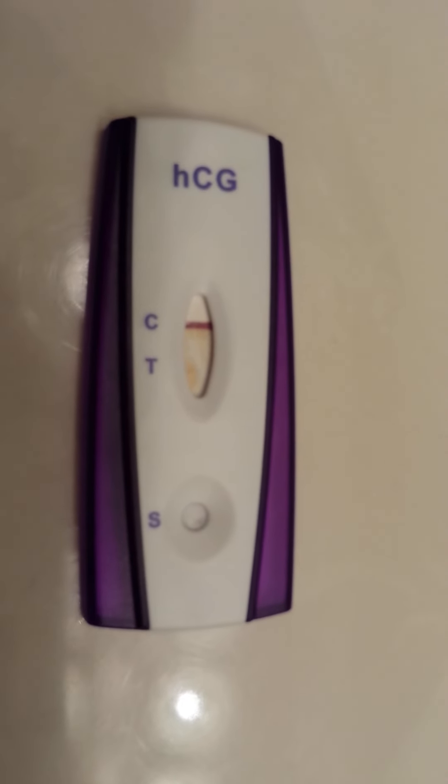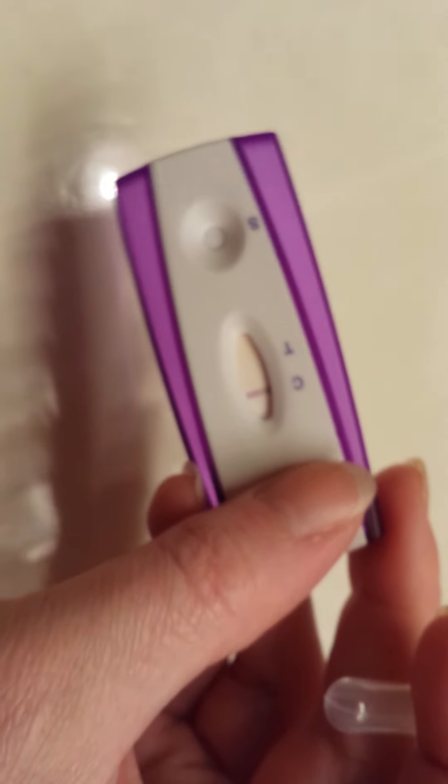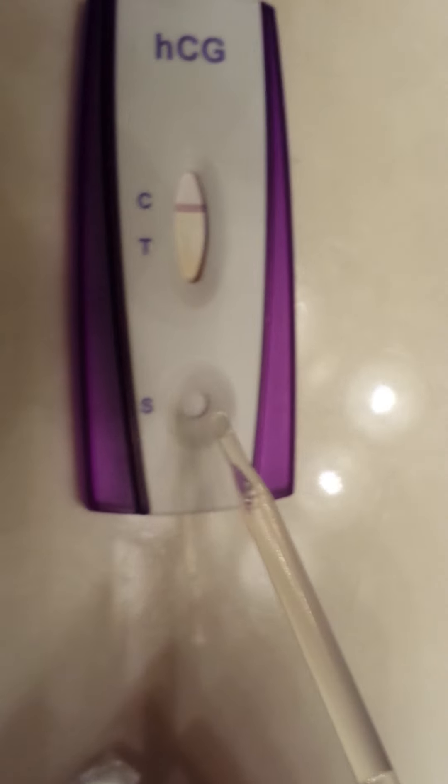For some reason my flash decided to turn itself off. I will come back to this one. I'm going to go to my other one. As you can see, again, definitely was a negative — if there was a line, which there's not, it usually indicates evaporation. So turn this around and here we go. I'm going to do one, two, three, four. Okay, there we go.